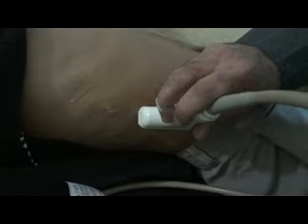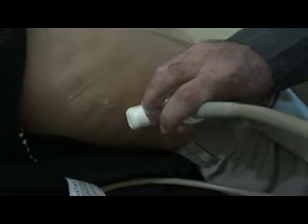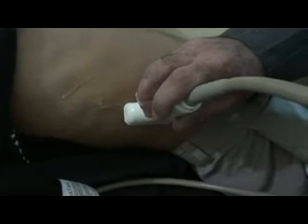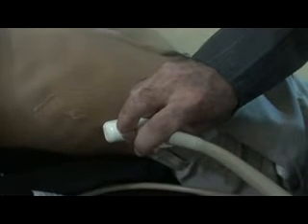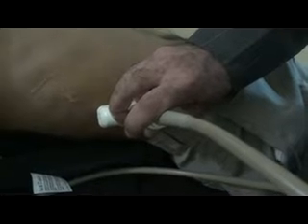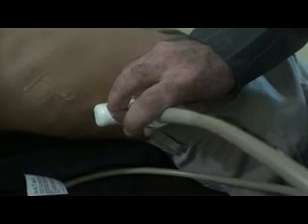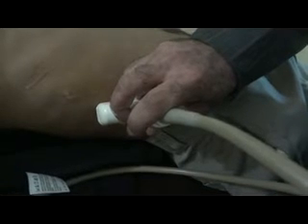This is the image. This is the liver. This is the right kidney. It measures 6.3 cm x 2.7 cm, and its parenchymal echogenicity is more as compared to that of the liver parenchymal echogenicity, which is opposite to the normal.